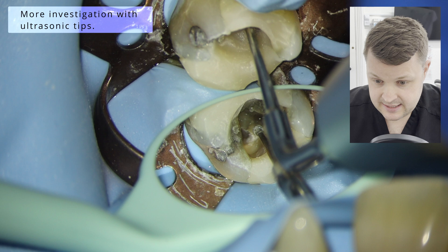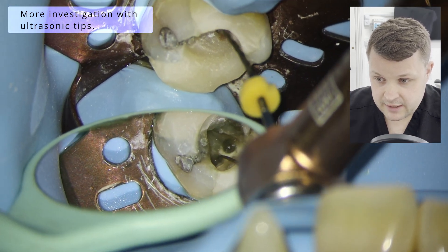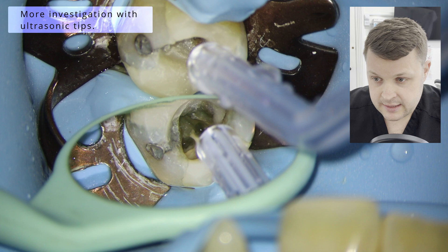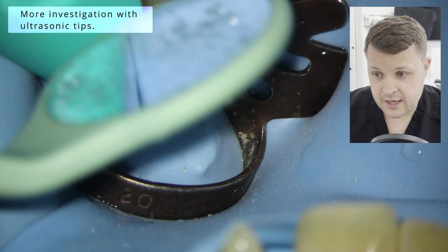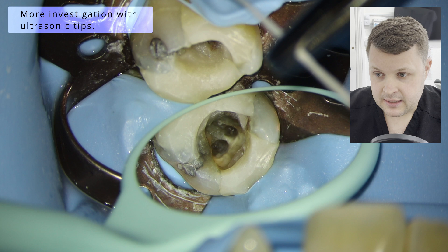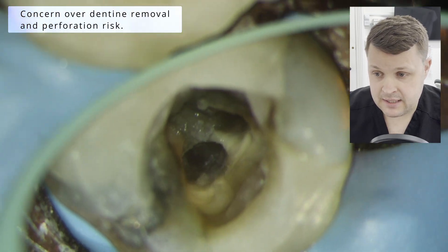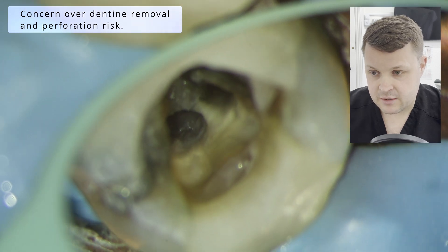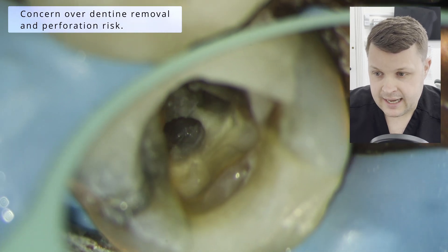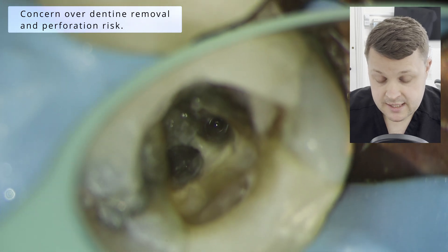So I've tried my best to have a little look, and I'm using this ball-ended burr again. I'm really, really thinking to myself now — I am removing a significant amount of dentin mesially to this mesial buccal canal, and I'm seriously concerned about perforating this tooth.